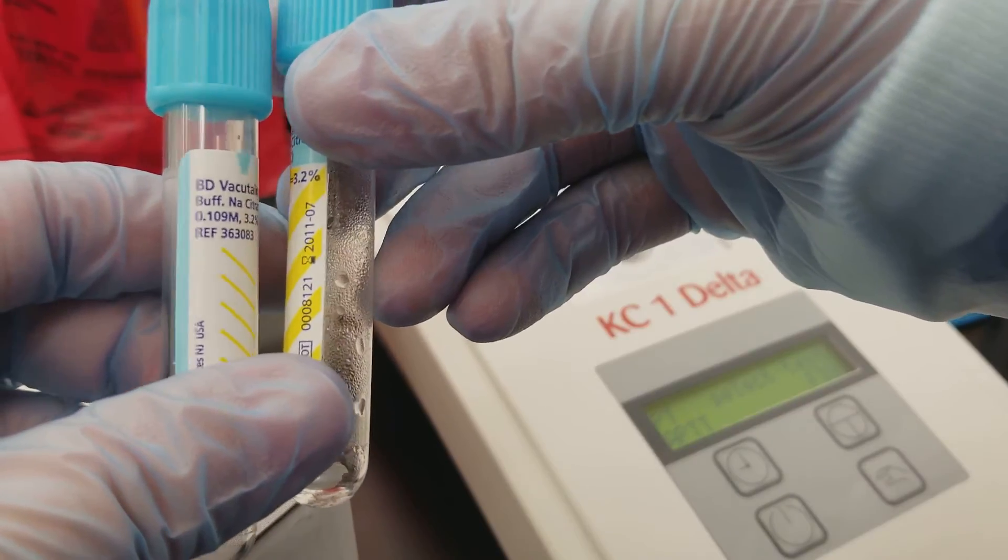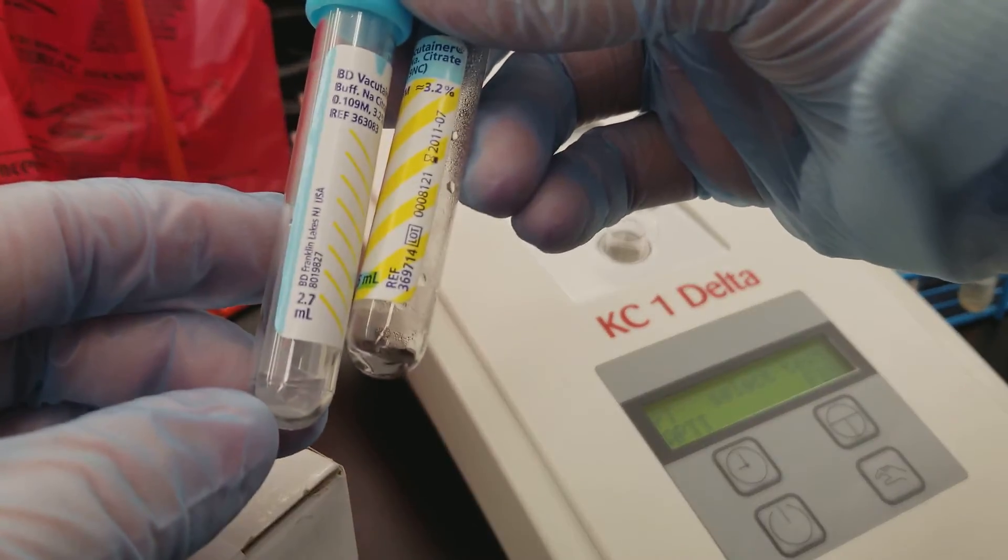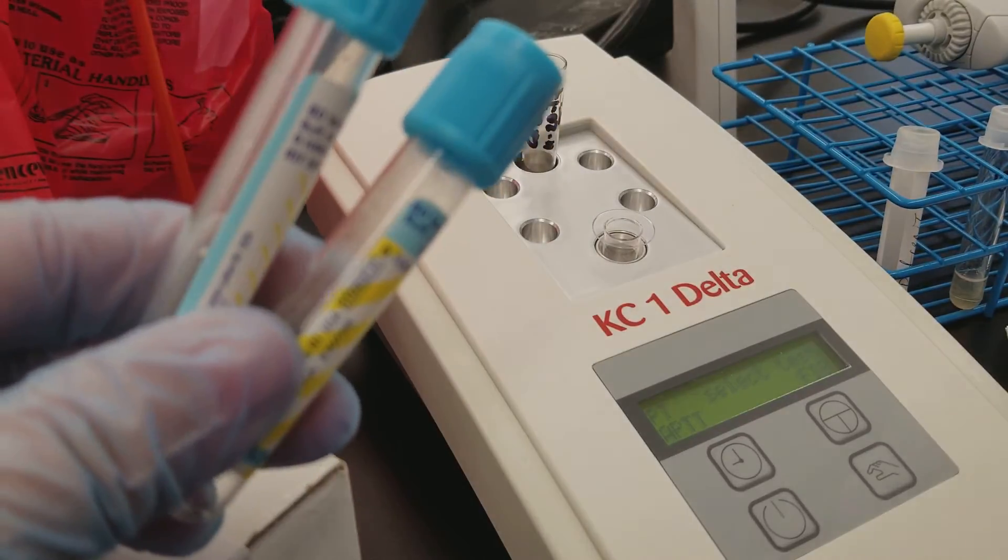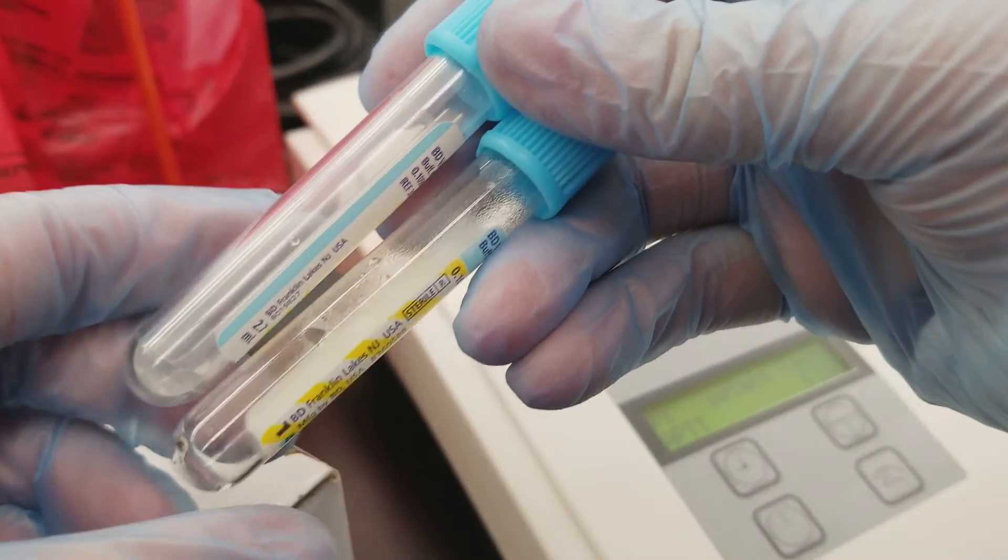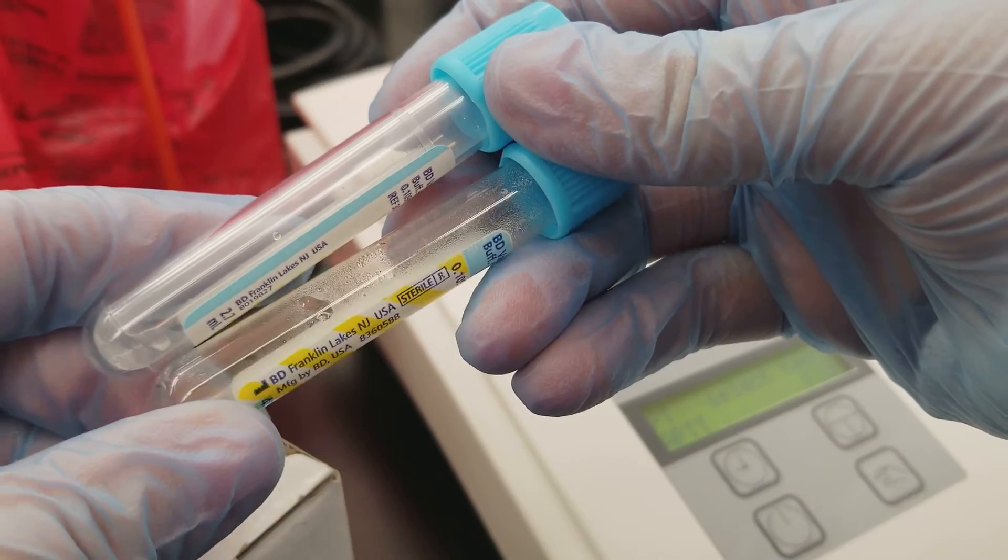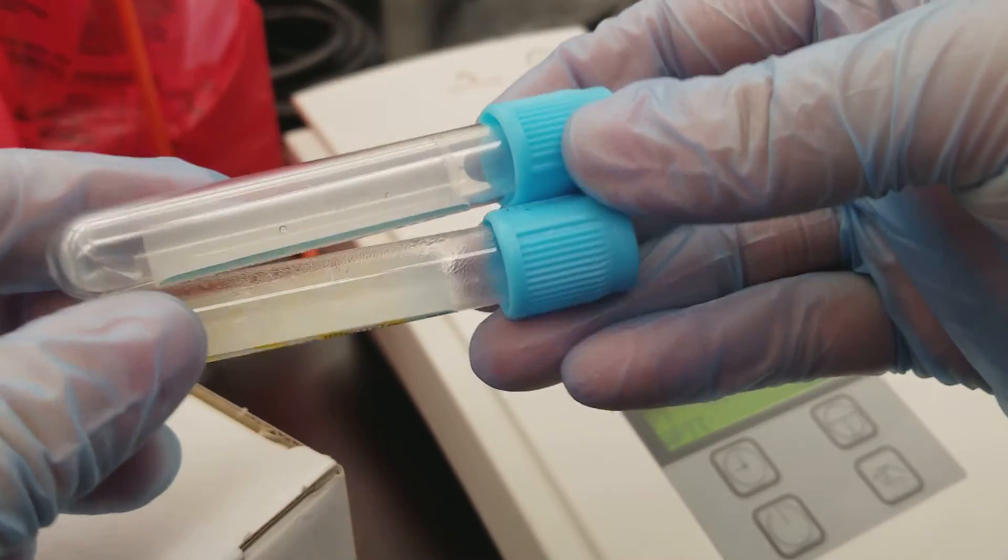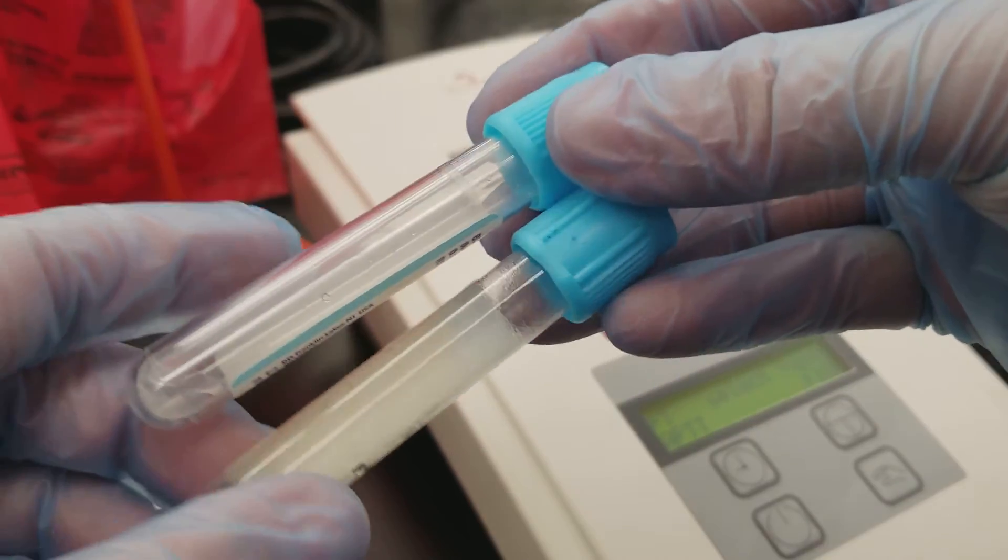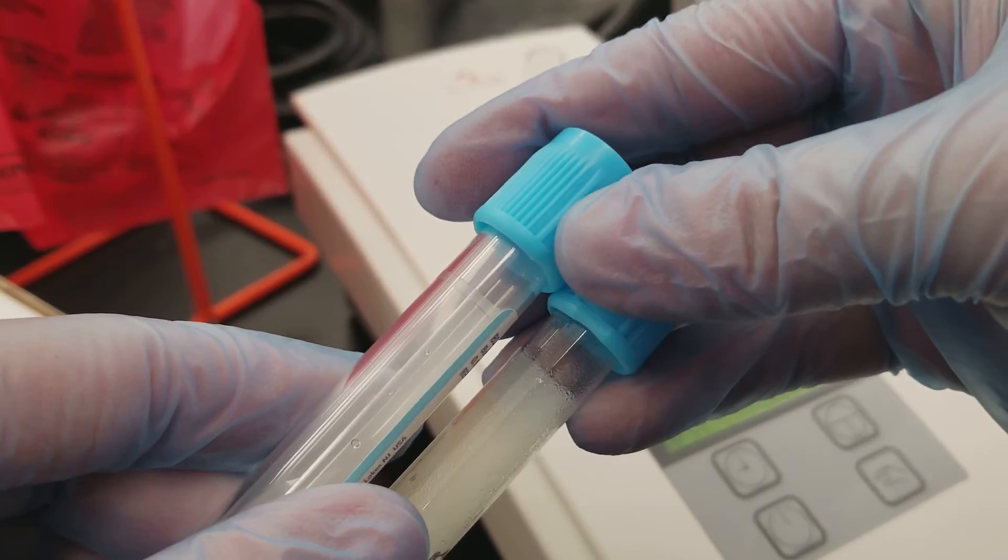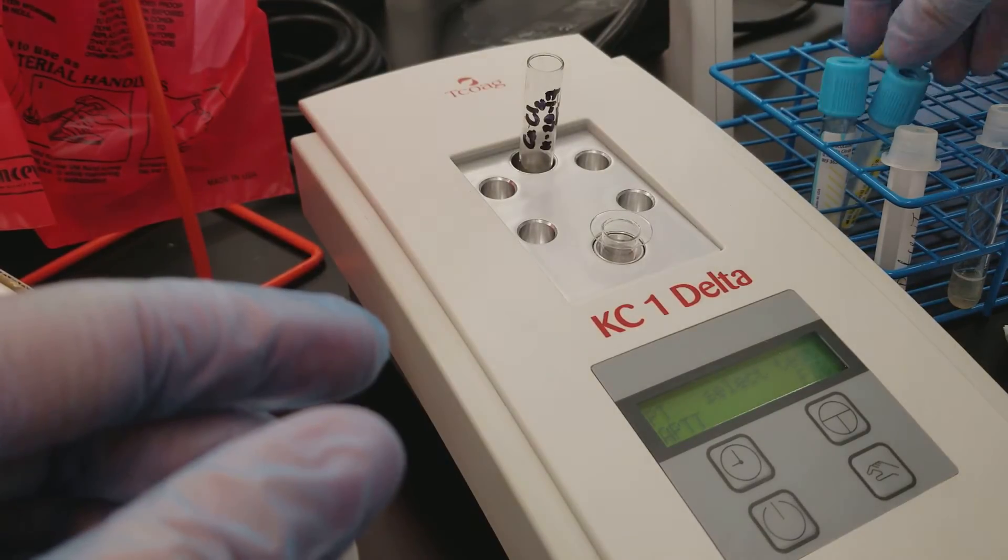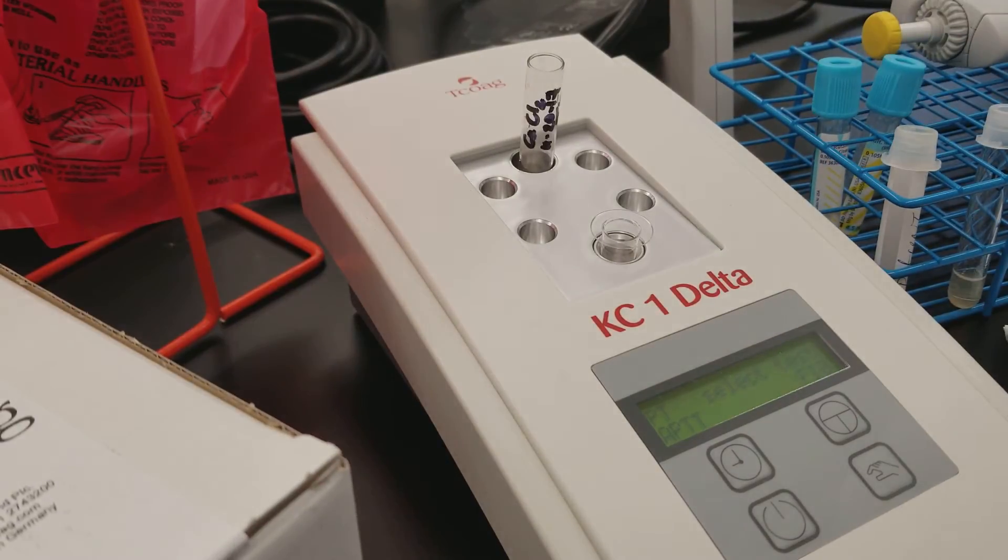And you want to have the fill line to indicate how much visually for the nurse or the phlebotomist to draw of the patient whole blood. And the reason that we want it to be 90 to 110% filled is that we want to make sure that our ratio for the anticoagulant is correct.